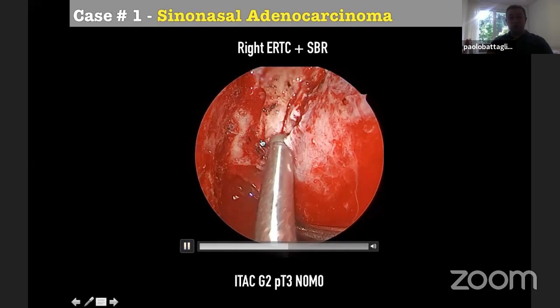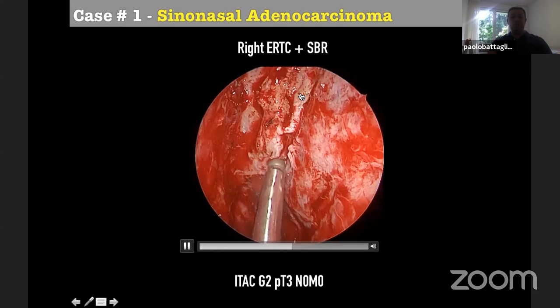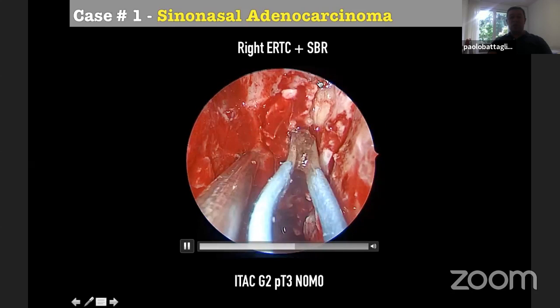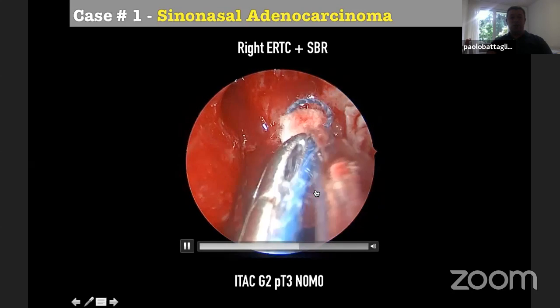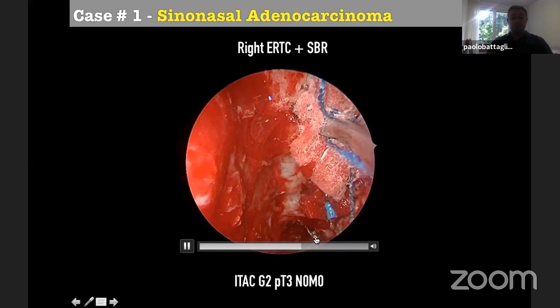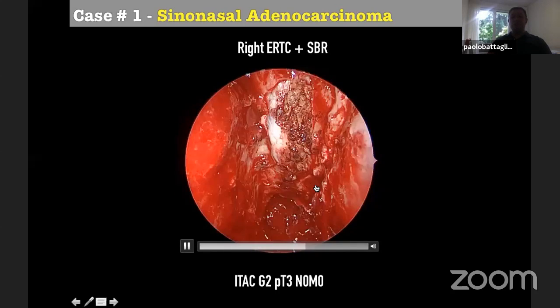So here we are drilling the crista galli anteriorly, you see, over here, and we drill till we have a smooth surface here in the upper part. So exposing the olfactory cleft, the ethmoidal roof, and then of course we have to remove the bone covering the ethmoid. Over here there was the tumor, so we send this bone to know if it's involved or not.